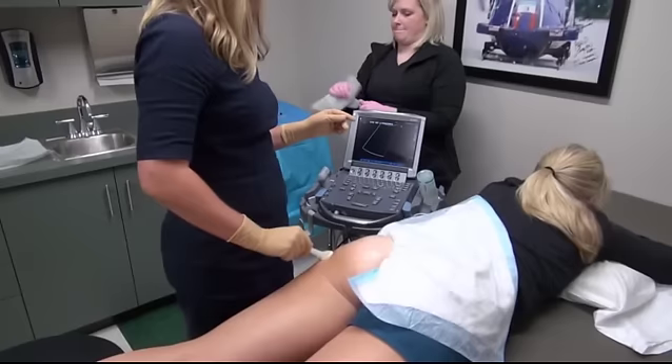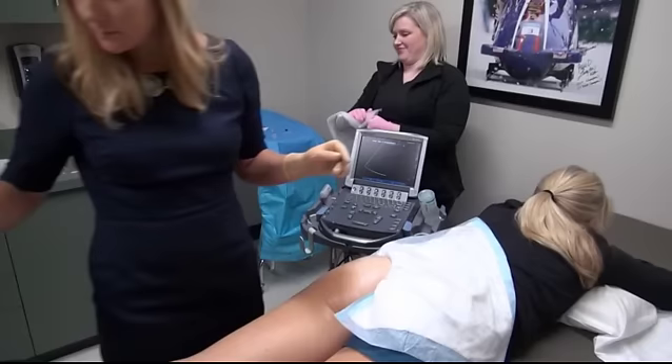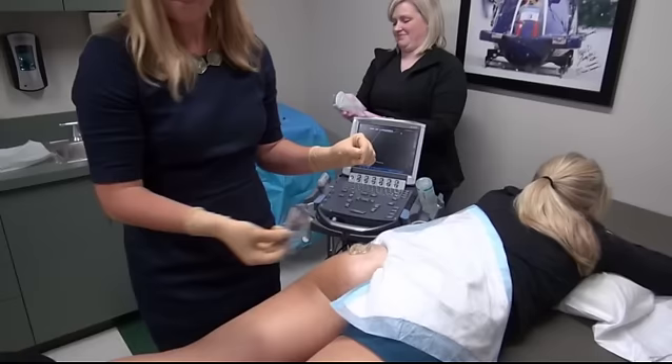The buttock is sterilized with a chlorhexidine swab. Betadine is not used as it can stain the ultrasound transducer. The entire buttock is sterilized down to the gluteal fold. The procedural assistant thoroughly cleans the ultrasound transducer with a germicidal cloth. The type of germicidal cloth safe to use on the transducer can vary, so it is best to check with the manufacturer of the system. Sterile gel is then placed over the gluteal area and the provider can be seated to perform the procedure.